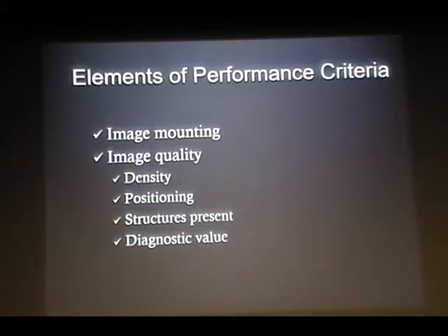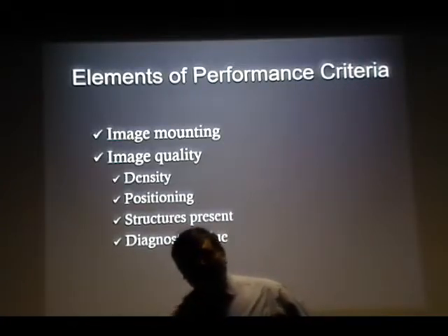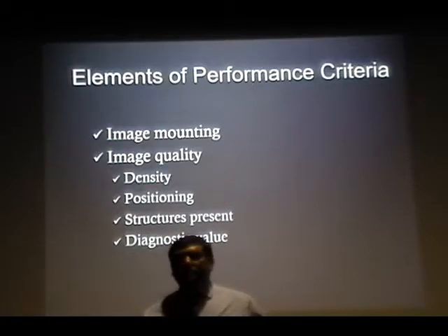Okay. So the things that I look at, image mounting. What exactly do I mean by image mounting? It is whether the radiographs are appropriately positioned or not. Say for instance, tooth number 1 is positioned on the template correctly. If I see that tooth number 32 has been placed in number 1, I will not even look into other things, because that's a waste of my time.